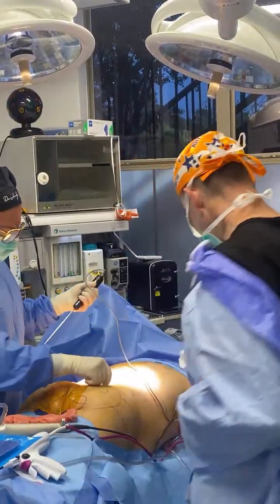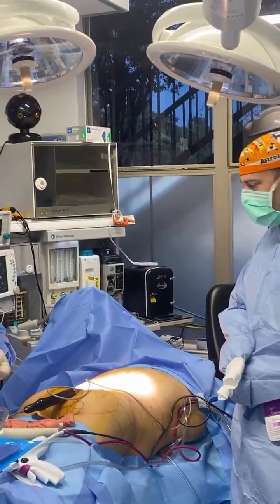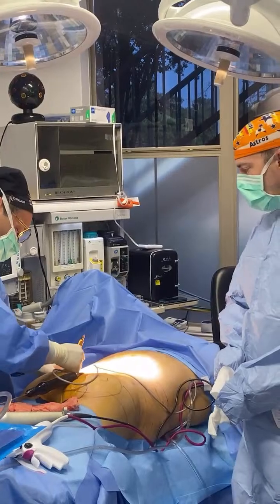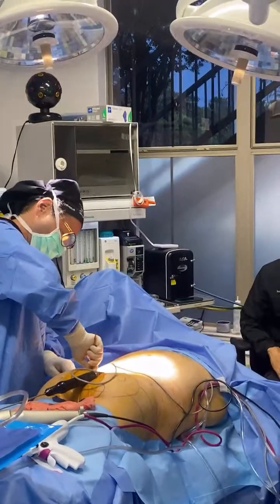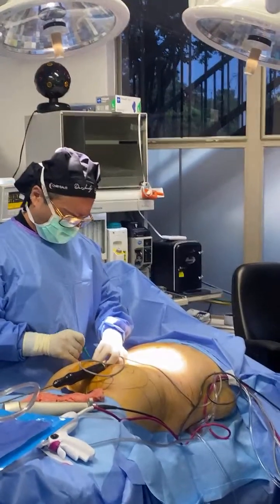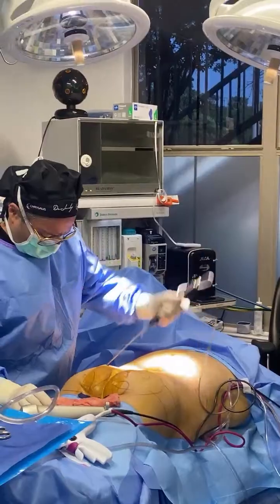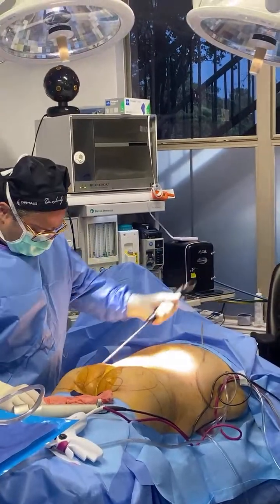Lower ab. Joyce asks, what surgery are you guys doing? We are doing a Brazilian butt lift with lipo 360 and Renuvion today. Earlier this morning, we got started at 7:30, and we went ahead and started the lipo 360 on our patient. We extracted some fat around her abdomen and her sides, and we paused to flip her over. We're just finishing up that lipo portion, and then we're going to move into the butt lift.